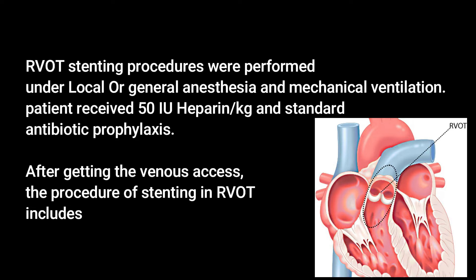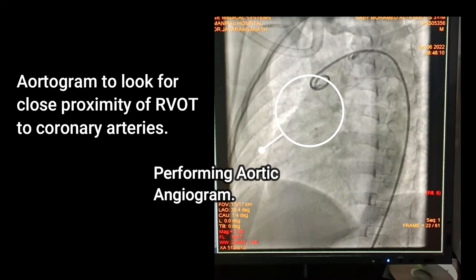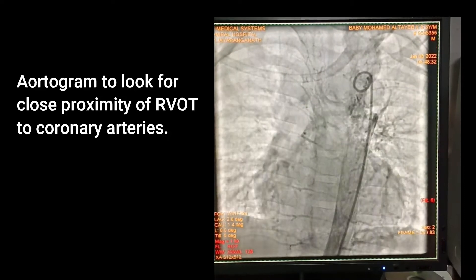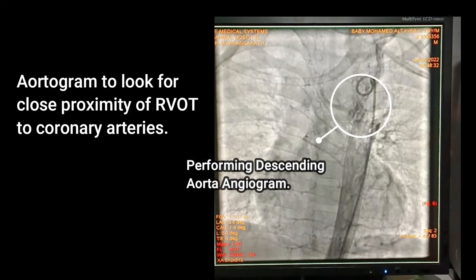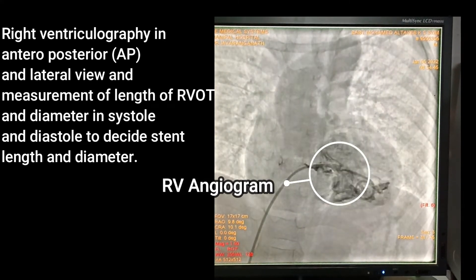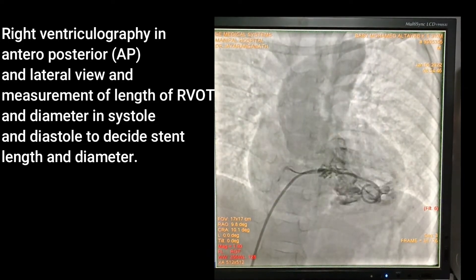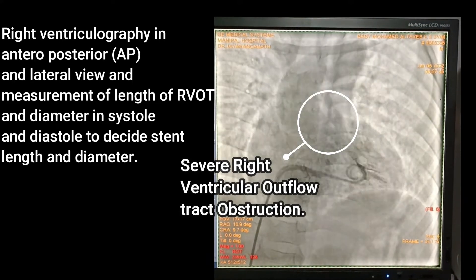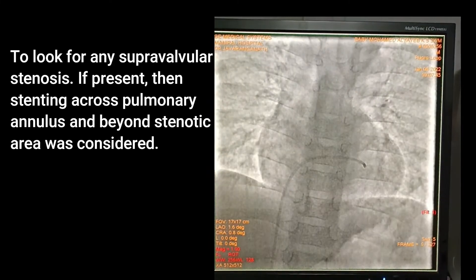the procedure of stenting in RVOT includes an aortogram to look for close proximity of RVOT to coronary arteries. Right ventriculography in antero-posterior and lateral view, and measurement of length of RVOT in diameter in systole and diastole to decide stent length and diameter, and to look for any supravalvular stenosis. If present, stenting across the pulmonary annulus and beyond the stenotic area was considered.